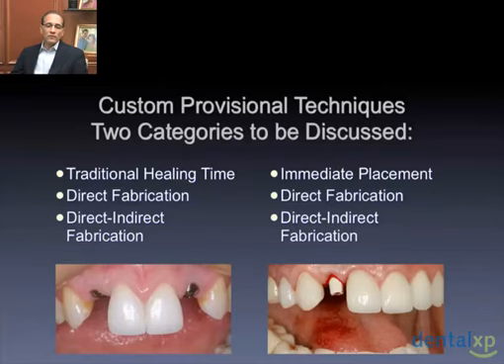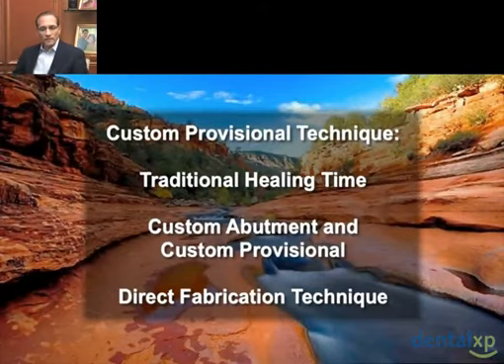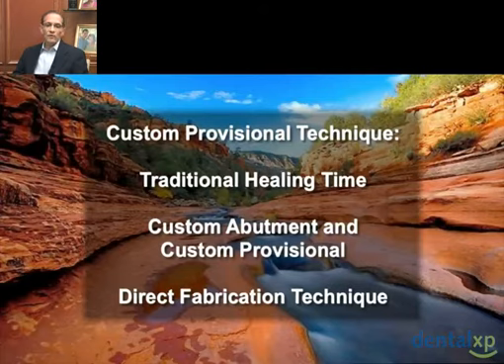Either technique can be utilized at either time, whether it be the direct fabrication or the direct indirect fabrication. It becomes your choice. What I like to do is break this down into segments and cover each one of the different choices one at a time. So let's first take the custom provisional technique during the traditional healing time. The patient has had the implant placed, integration has occurred, and we're going to make the custom abutment and custom provisional with a direct technique.